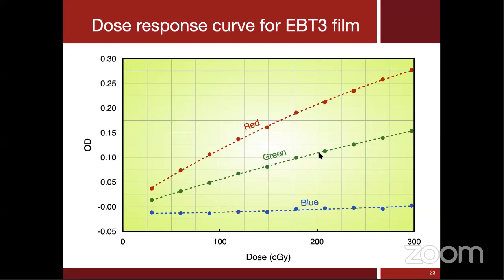We have more questions, so let me see which are the most important ones. What is your experience with small field dosimetry? Have you done any small field dosimetry using these films? Not yet. Another practical question: 300 dpi results in too many unrealistic spikes even within a uniformly irradiated film.